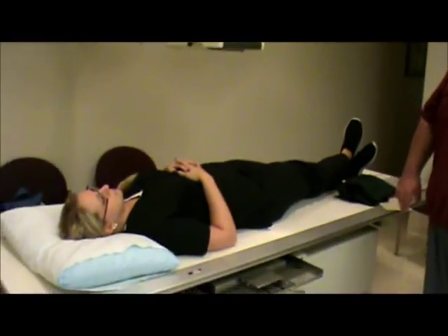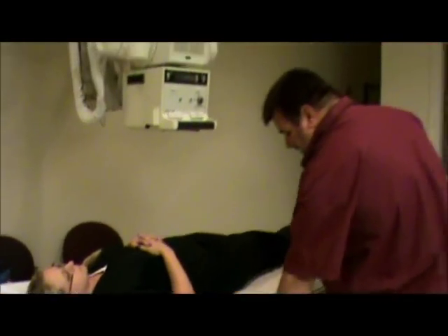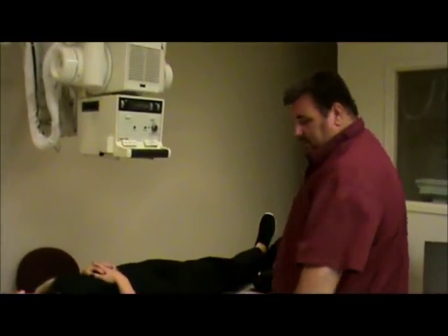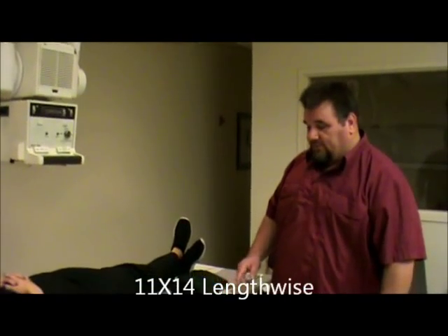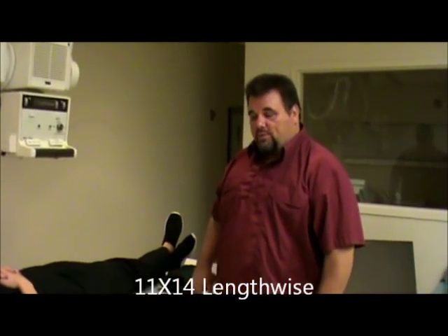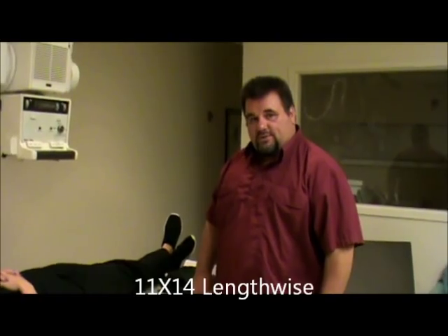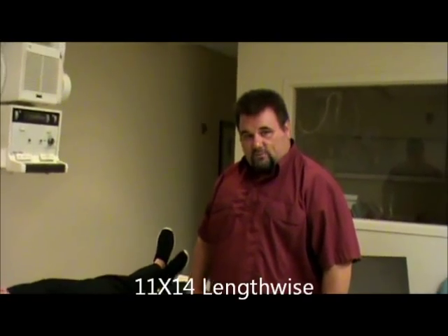We're going to start with the AP lumbar. The patient will be laying supine on the table. Our film size will be 11 by 14 lengthwise. Also for the lateral it will be 11 by 14, and when we do the spot film we'll change to a 10 by 12 lengthwise.